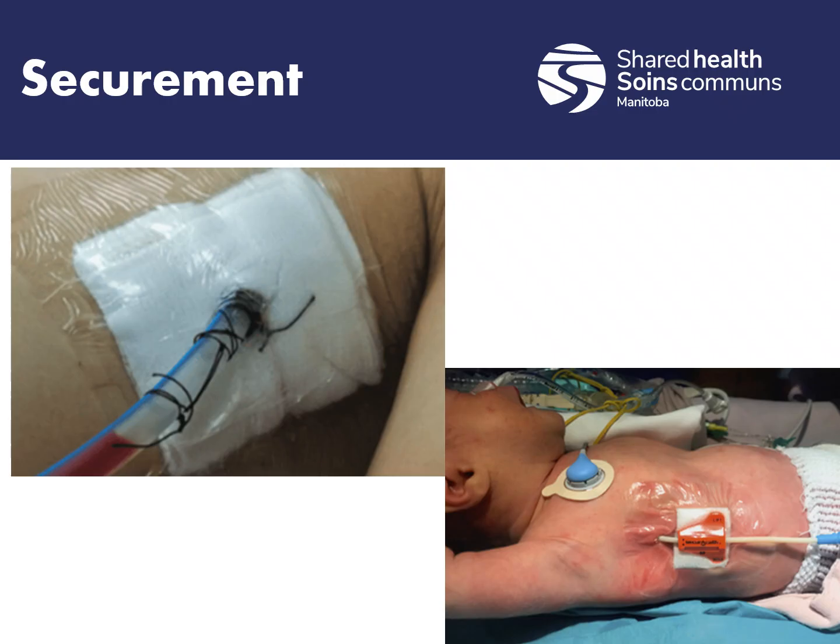So again, it's good to look at the actual wound site and make sure there's nothing leaking through the dressing, because obviously if there's blood or some kind of strange fluid, such as pus, coming out through that dressing, the chest tube isn't secured properly, and we need to get it inspected before we go.